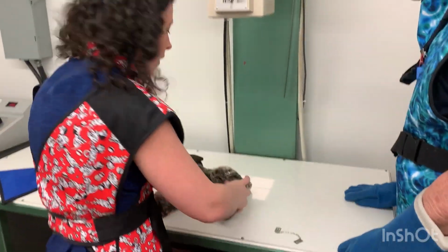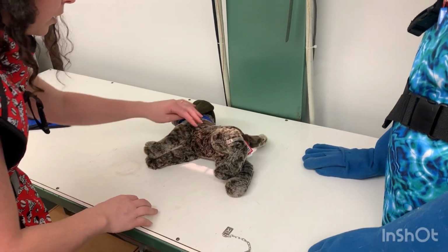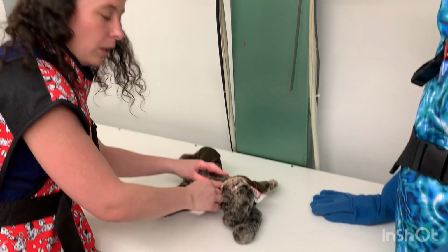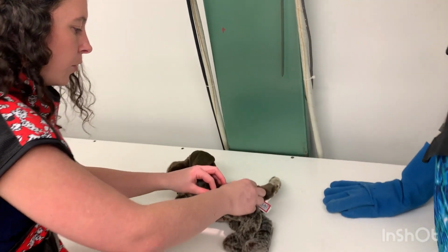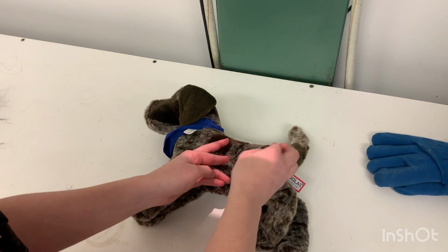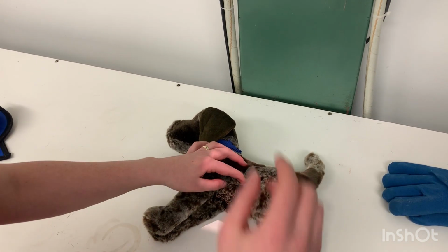So we need to position our patient. We'll start with our right lateral radiograph. Our markers here are going to be at our 8th rib. So we would count backwards, start at your 13th, count up 12, 11, 10, 9, 8, get to the point there, and then you need to make sure, so you feel the rib, and then get to the greater trochanter, which is the point of the hip, and that's the area that we need in. So that would be our collimation field essentially.